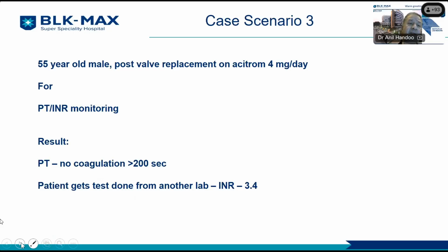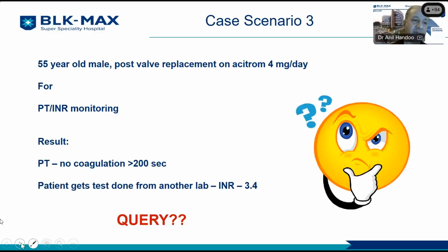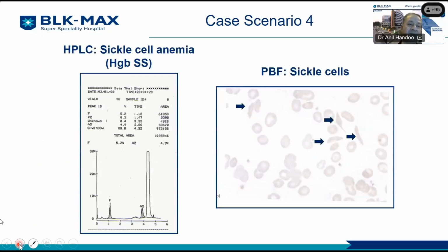So in this particular case, why were we not really concordant is because there is something called reassignment of ISI. Sometimes when you get the reagent, this reagent may not be what it ought to be, and you have to verify the ISI value of the reagent to get the values which are correct. So if you look at PT-INR, INR at lower limits was always matching, and our QC was passing very well. But the moment the INR goes to the higher values, the values would become too high for us to get the value which was correct. So therefore, in this case, we had a major challenge, which was reassignment of ISI, which we did later on.